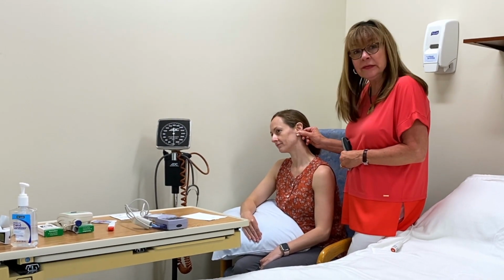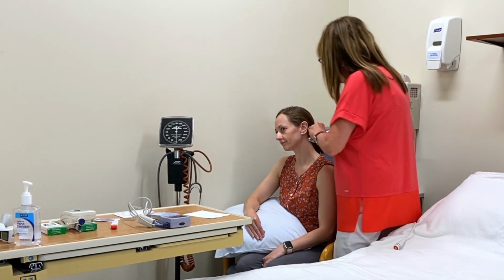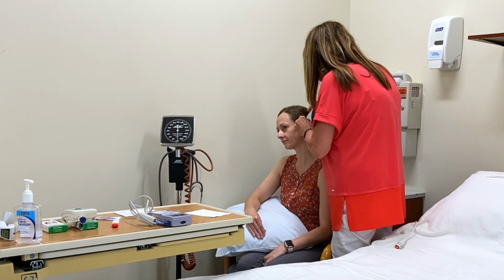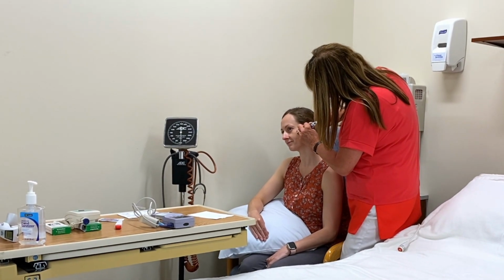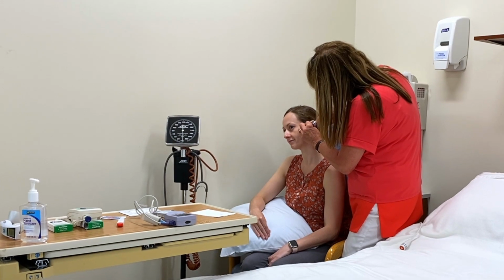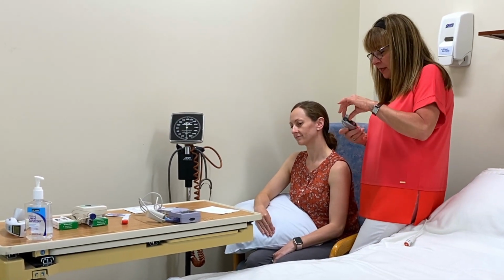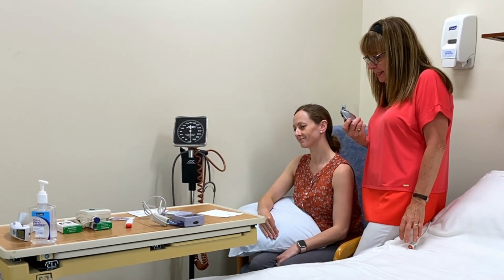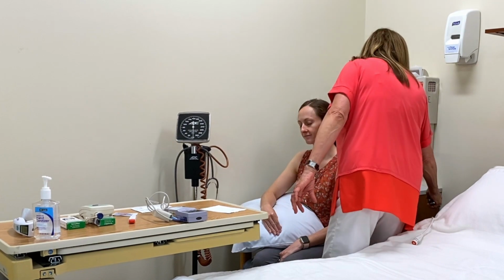On a child under the age of 3, down to straighten out the canal. So I'm going to put this in Monique's ear. Okay. And her temperature here is 98. So that is still considered normal.